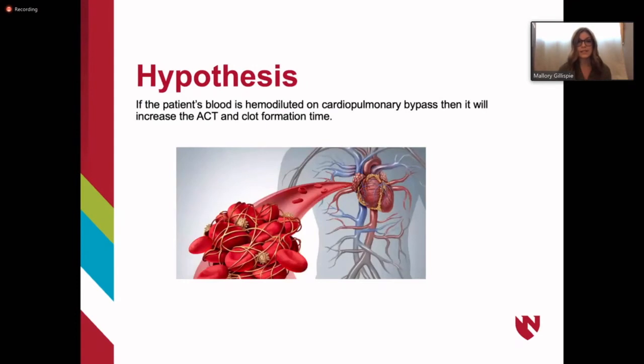So our hypothesis was that if the patient's blood is hemodiluted on cardiopulmonary bypass, then it will increase the patient's ACT and clot formation time.